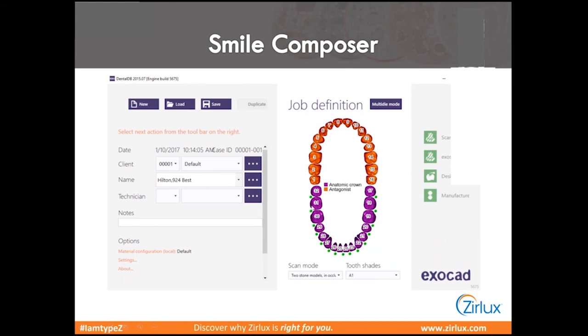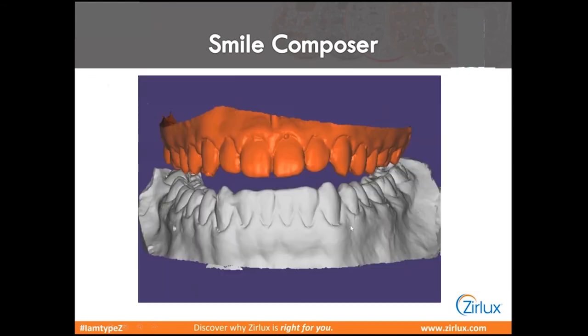Let's talk about the Smile Composer. Exocad is one of the softwares you can use, but just about any software that can make a crown can make one of these. You'll have some workarounds with different softwares. What I found specifically with Exocad is just marking each tooth as if it's a prepped tooth even though it's not, and telling the software that you want to make a full anatomic crown that's splinted together. So you can see we have these marked as full anatomics, splinted together all the way around.